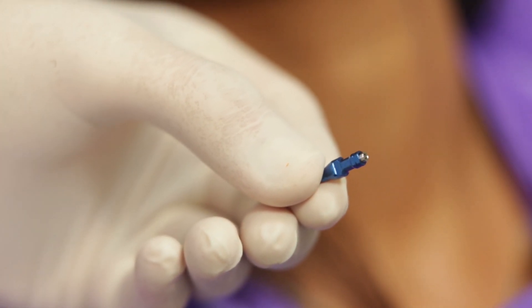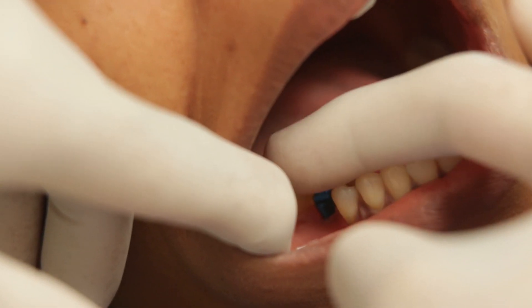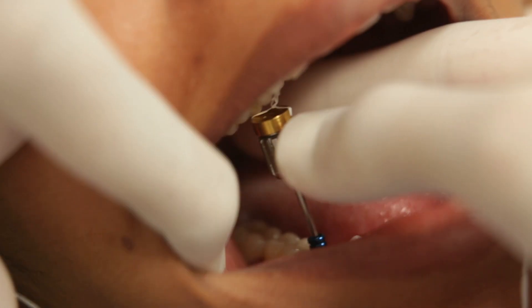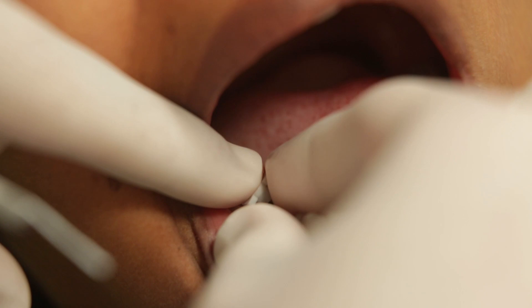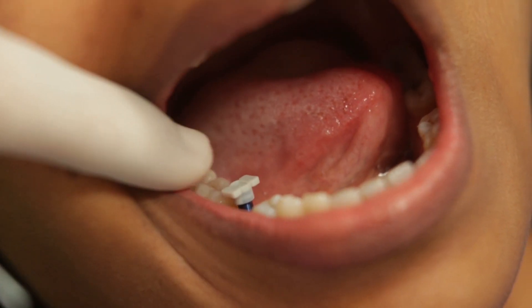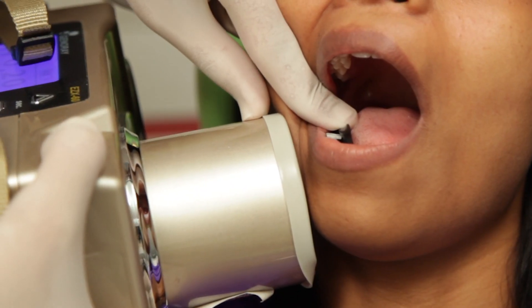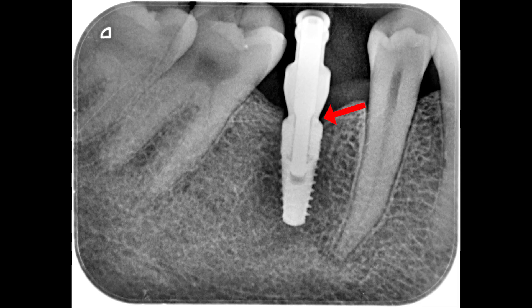This is what the closed tray impression coping looks like. I am now going to seat the impression coping onto the implant and tighten the screw. I will also place this impression cap on top of the transfer coping — this cap will be picked up along with the impression. It is extremely important to take an IOPA at this stage to check the fit of the coping with the implant. You should not be able to see a gap there.